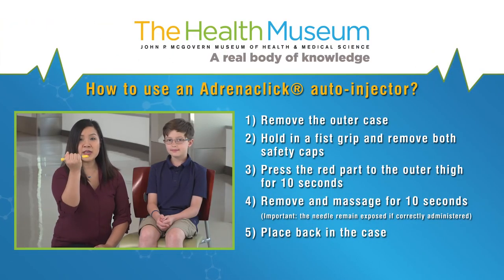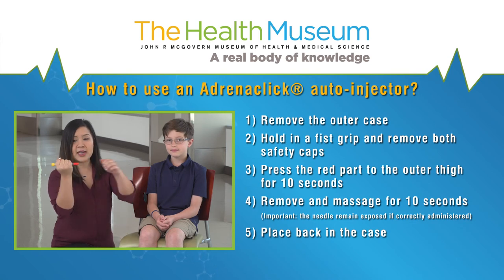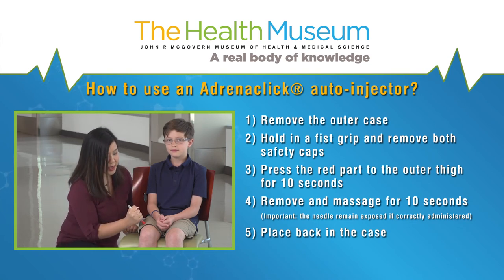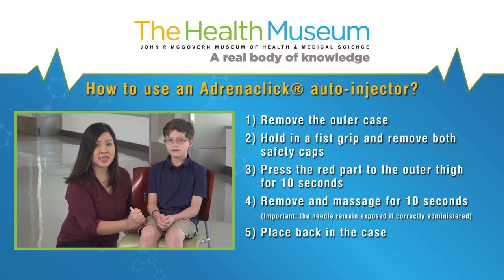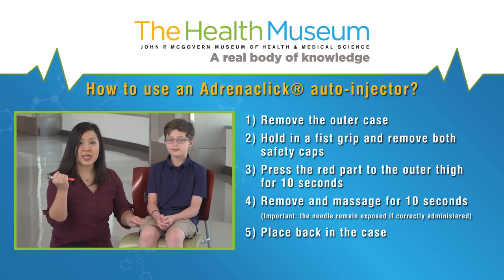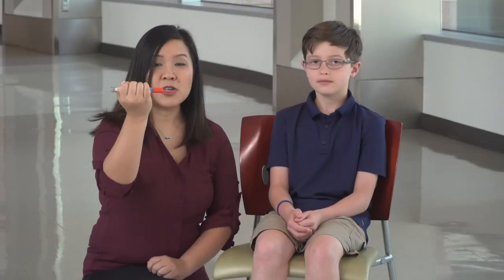Next, we have Adrenaclick. If you are ready to use, remove the outer case. There are two safety caps. Hold in a fist grip and remove both safety caps. Press the red to the outer thigh and inject for 10 seconds. Remove and massage the site for 10 seconds. You will note that the needle will remain exposed — this will indicate that the correct dose has been administered. Place back in the case.